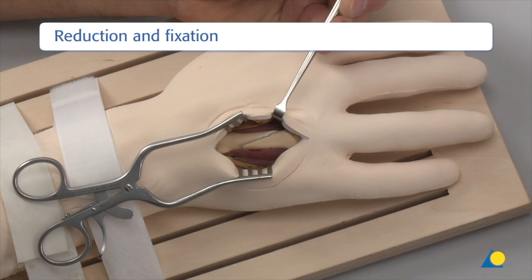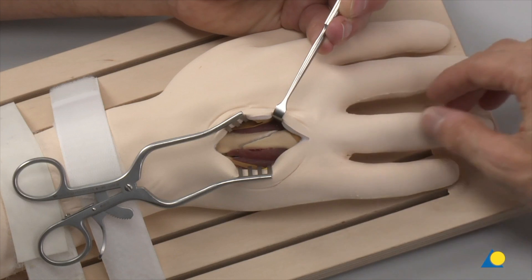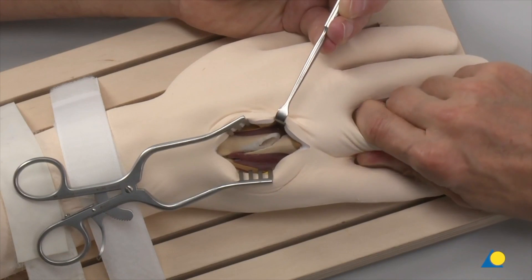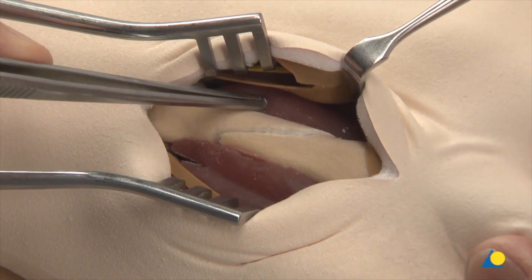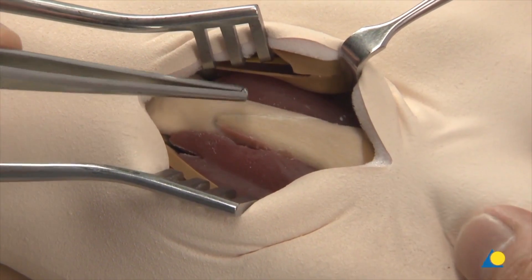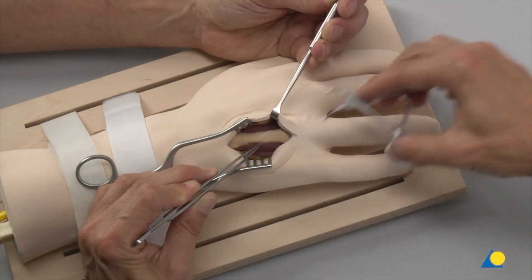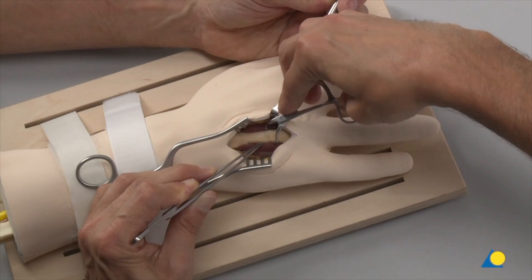To check for interposed soft tissues and additional fracture lines, the fracture zone can be better visualized by rotating the distal fragment away from the proximal fragment, opening the fracture. The fracture plane and the size of the fragments are visualized to precisely determine the subsequent screw position. After anatomical reduction, the reduction is maintained with a small reduction forceps using axial pull and rotation.